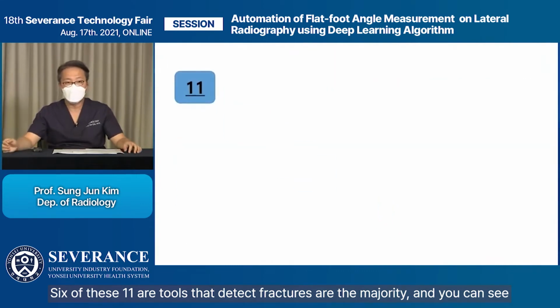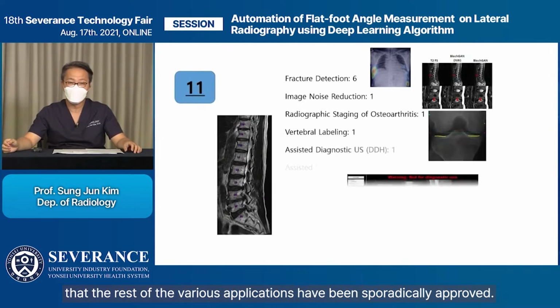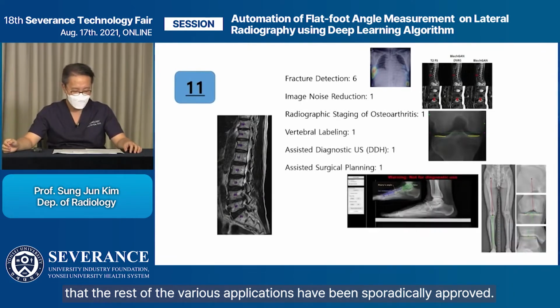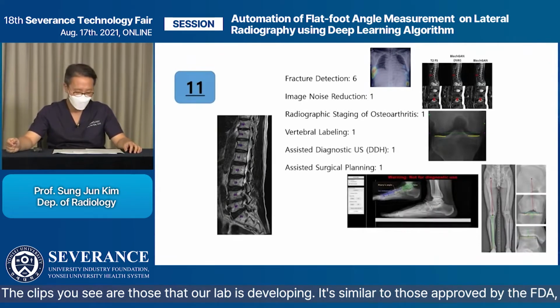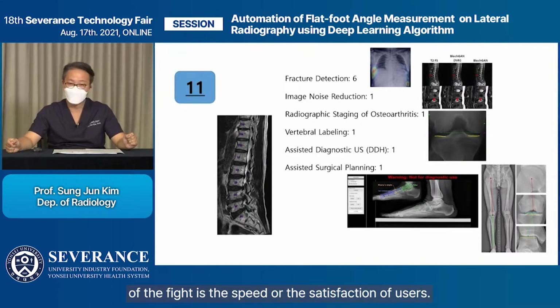Six of these 11 are tools that detect fractures, which are the majority, and you can see that the rest of the various applications have been sporadically approved. The clips you see are those that our lab is developing. It's similar to those approved by the FDA, so everyone has similar ideas, and I think the basic point of the competition is the speed or the satisfaction of users.